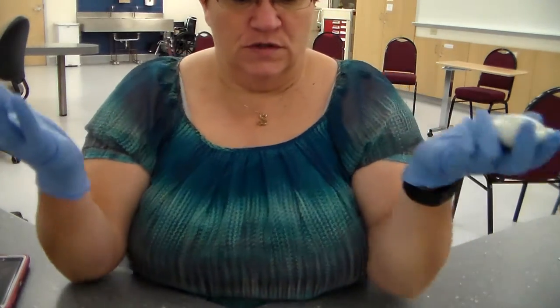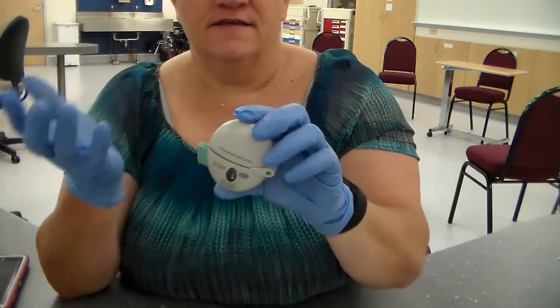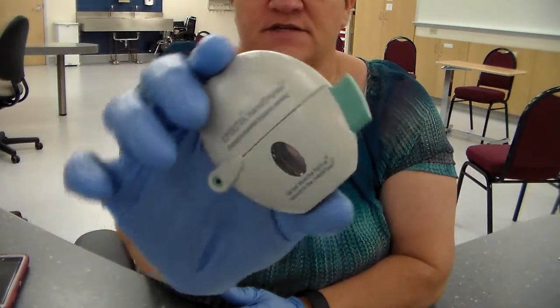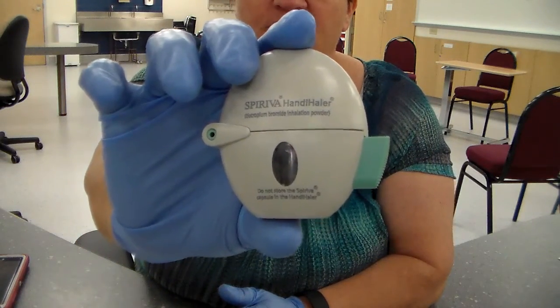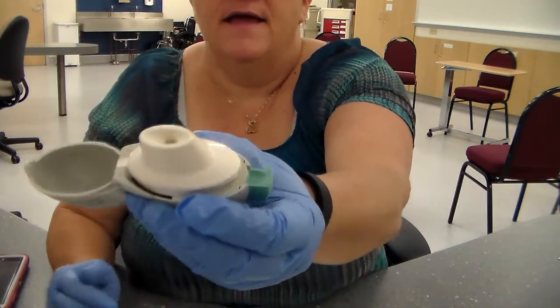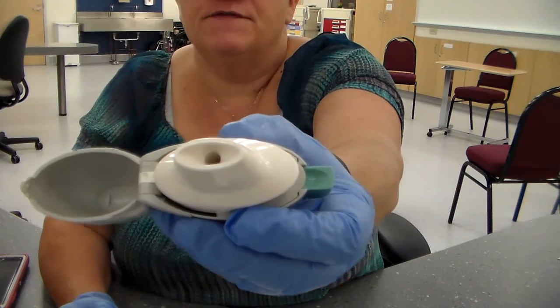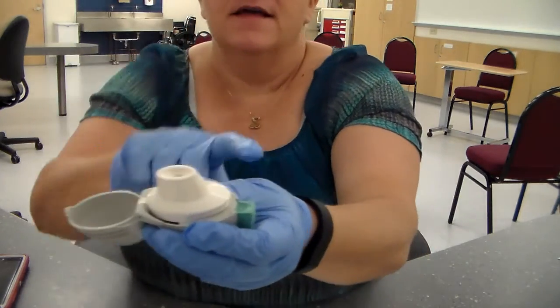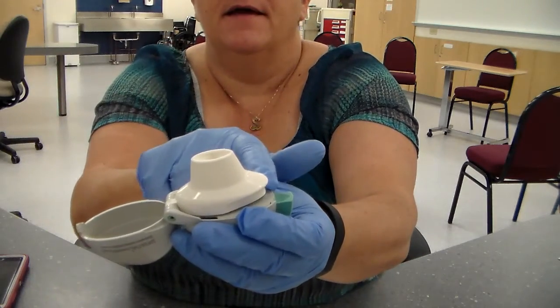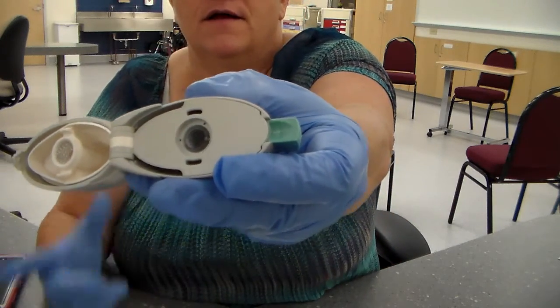So how do you use the dry powdered mechanism? This is a Spiriva inhaler. It looks kind of like an egg, right? So it's closed, and then what you do is you just pop this open, and that's where the patient's going to put their mouth around and breathe in. But first of all, you need to put the medication in there. So this white part pops open, just like that. And then that's where the capsule will go.